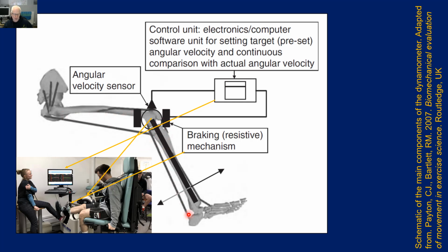It's nothing to do with any of the other muscles, and that's the one thing that differentiates isokinetic dynamometry from more conventional measures of strength. It is very much about isolating the joints that we're interested in, and therefore the muscles that are used to articulate that joint.